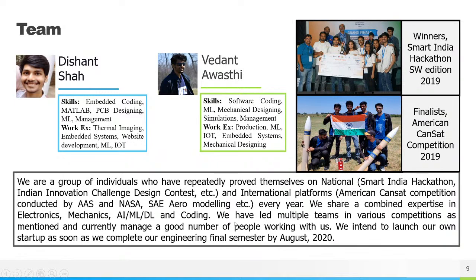We are trying our best to at least develop some kind of novel device, and we share a combined expertise of electronics, mechanics, AIML, and coding, and we have led multiple teams. So we are trying to make this a commercial product, and we intend to develop and found our own company by the end of, I think, August, once our semester ends.